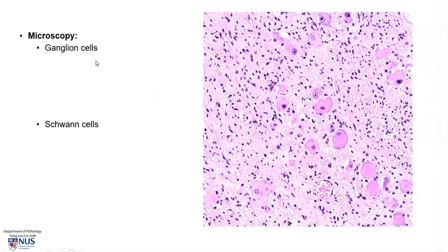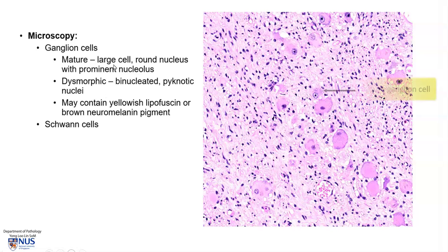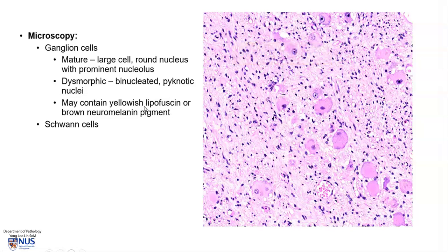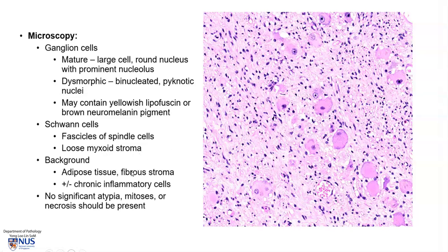Microscopically, ganglioneuromas are composed of two main components: ganglion cells and Schwann cells. Ganglion cells can be mature, with a round nucleus and prominent nucleolus, or they can be dysmorphic — binucleated with dark degenerate pyknotic nuclei. Sometimes you can see yellowish lipofuscin or brownish fine granular neuromelanin pigment in the cytoplasm. Schwann cells look very different; they are usually arranged in parallel bundles or fascicles and have spindle, very elongated and slender nuclei. There may be a myxoid grayish stroma around the Schwann cells.